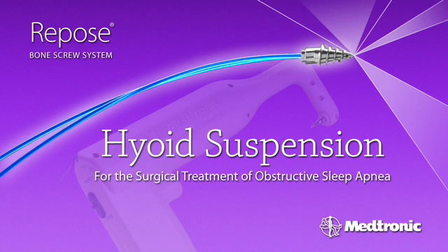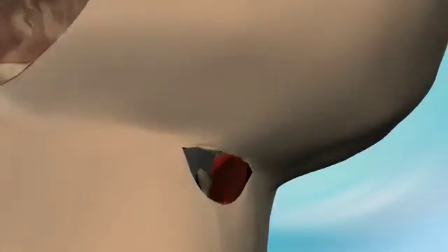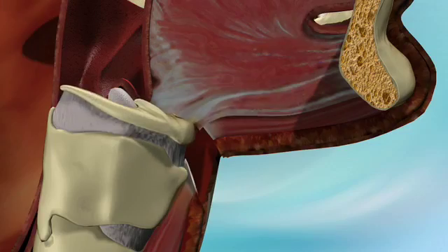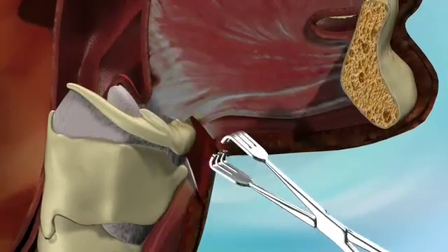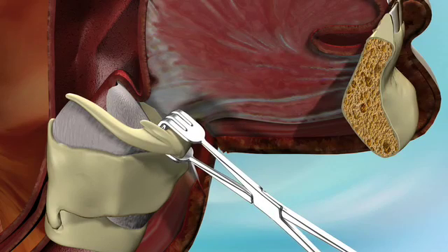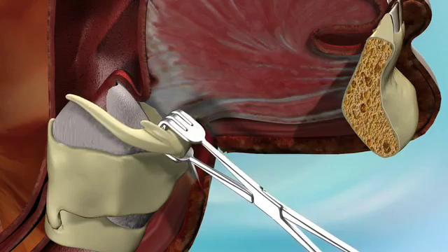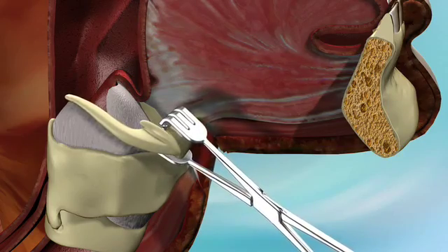The Repose 4-suture hyoid suspension technique for the surgical treatment of obstructive sleep apnea. After initial neck dissection, the surgeon skeletonizes the midline superior aspect of the hyoid bone until a Leahy or Alice clamp can sufficiently grasp the midline hyoid. If the hyoid appears immobile, additional detachment of the midline infrahyoid muscles is performed.